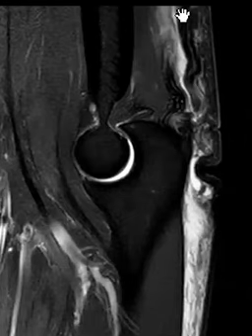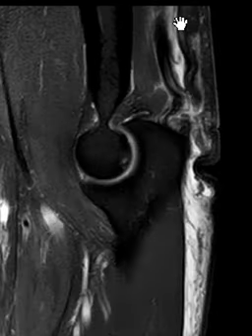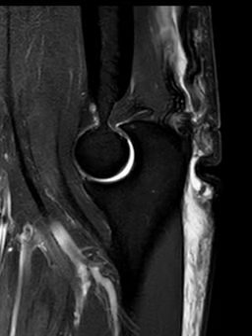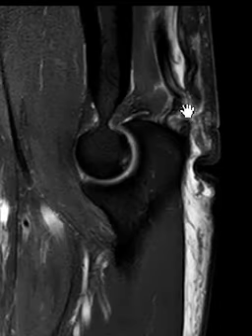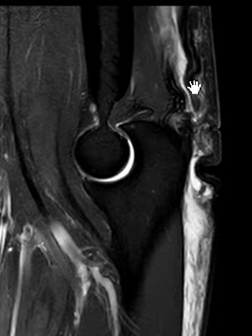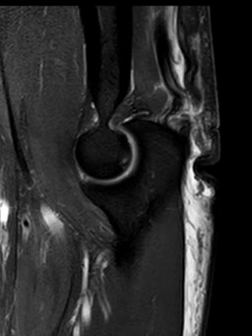So we're really looking back here at the triceps tendon. We can see that definitely there is a tear. So to help the surgeon out, we need to tell him what is going on. And it looks like there is a longitudinal component, a vertical band of fluid, hemorrhage, or edema, separating the triceps into a back superficial component and a front deep component.